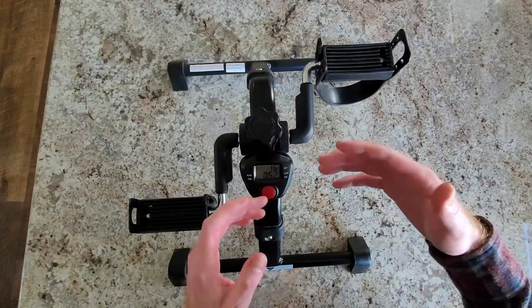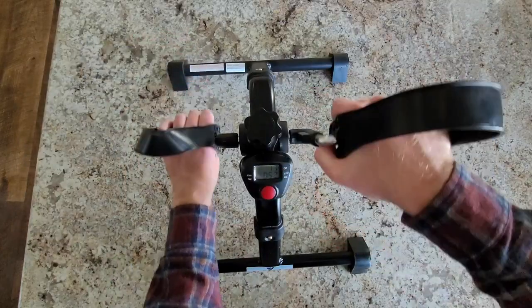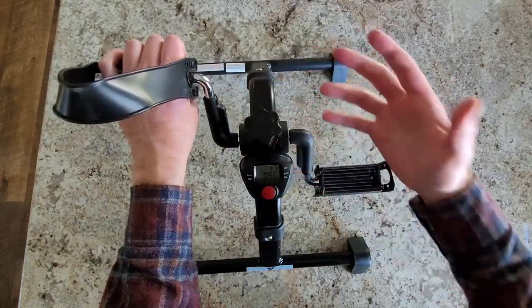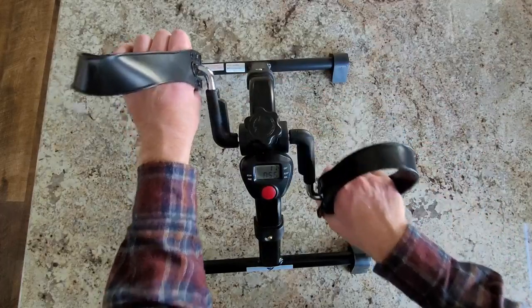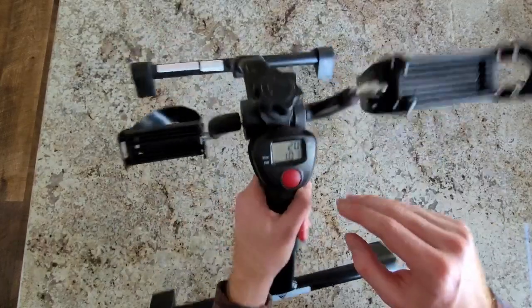You could turn it from more of a leisurely thing into a straight-up exercise. Now I have it tighter and it's just harder to push. With the legs, I can spin this more and more to really give me a good workout, to work my legs, to make me feel better. And now you can see the counter going up even more, the time going up.